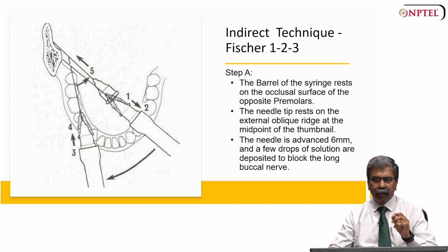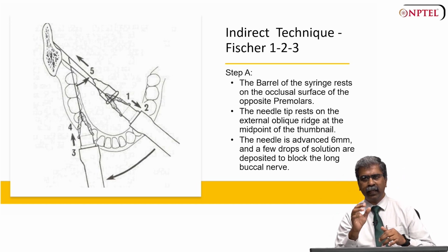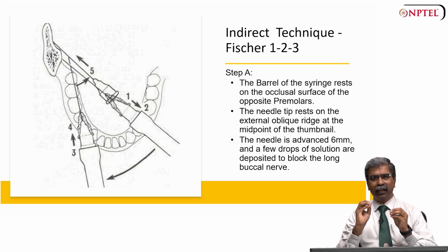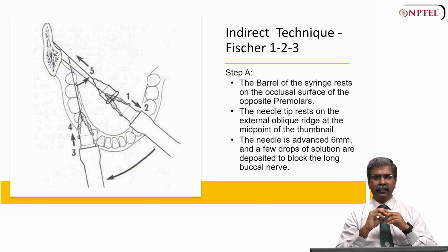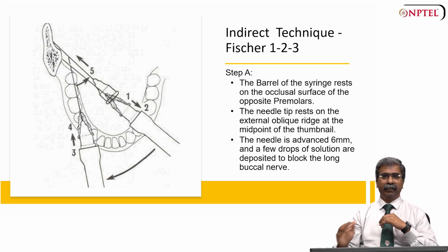And then you advance the needle 6 millimeters to 8 millimeters into the tissue, and this depth is sufficient to reach the area where the long buccal nerve can be effectively anesthetized. A few drops of local anesthetic solution are deposited at this point for successfully blocking the long buccal nerve, providing anesthesia to the buccal mucosa, and also for a painless injection.